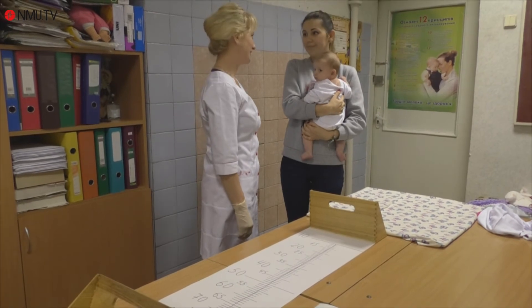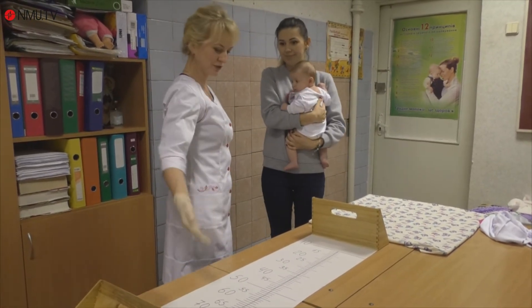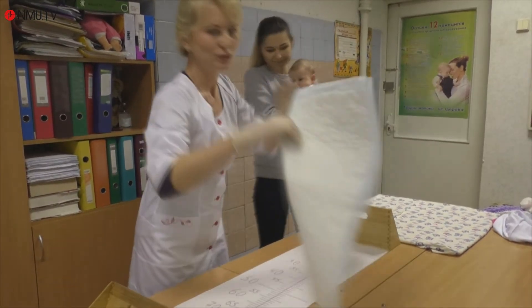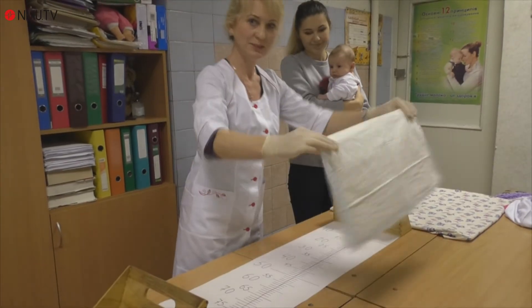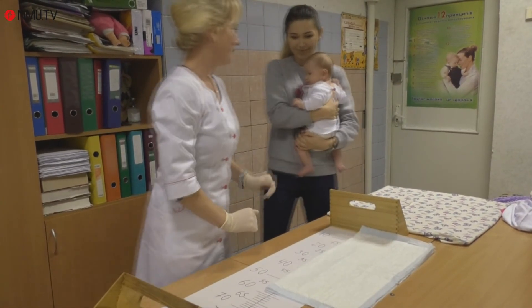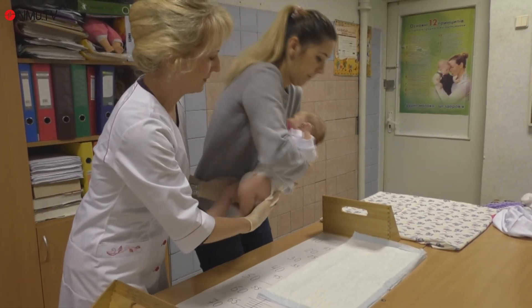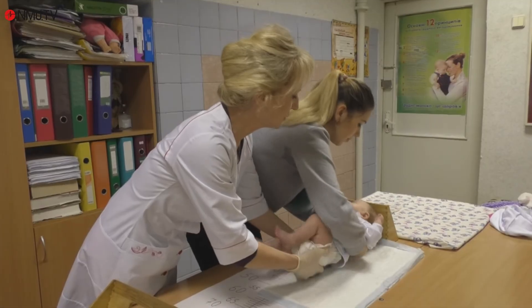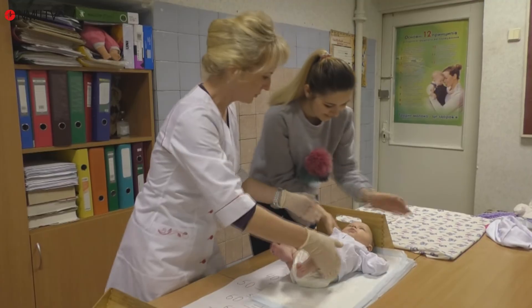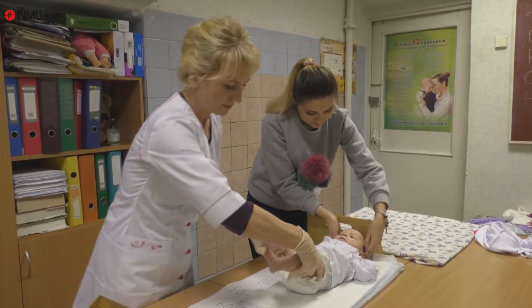The next step is to measure the length of the child's body. To do this, we use a horizontal growth meter. During the measurement, mother supports the child's head. We put a blanket on the growth meter to prevent overcooling. The baby should be laid so that the crown touches firmly to the fixed bar of the growth meter. Mother supports the head from both sides.